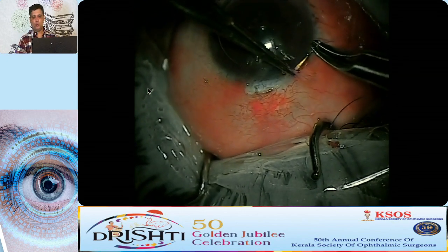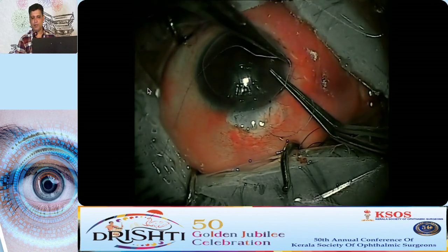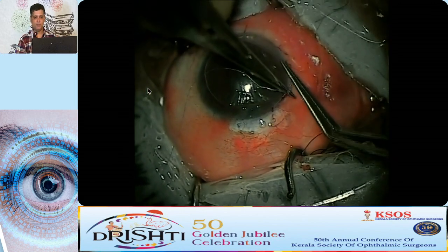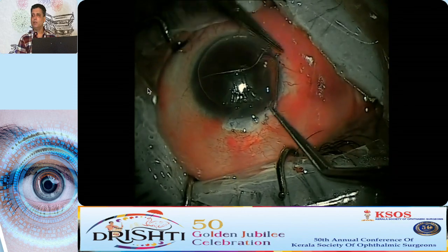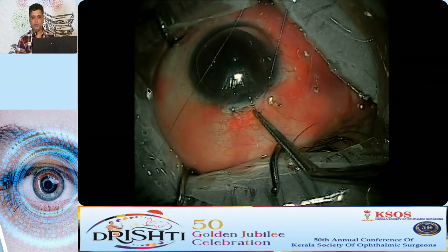And the two edge anchoring sutures, I try to take a bit of the episcleral as well to make sure they are well anchored on either edges. And subsequently, you can use a mattress suture or even simple interrupted sutures in the adjoining areas.